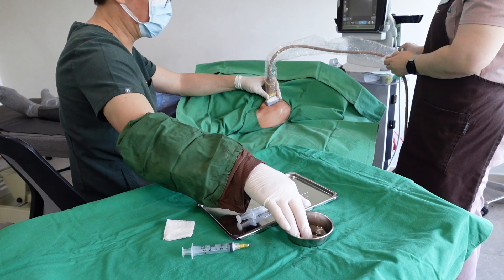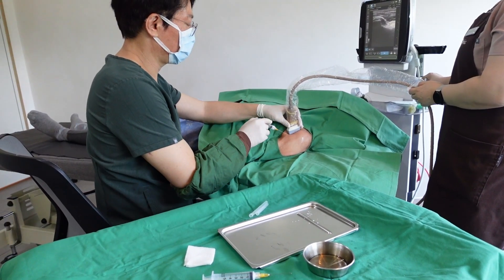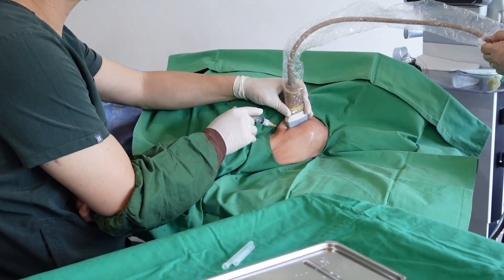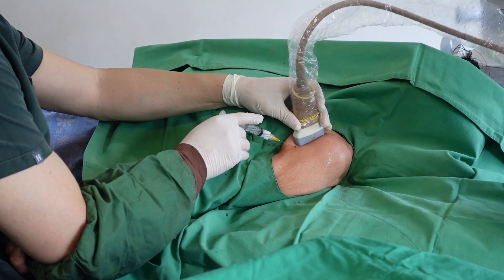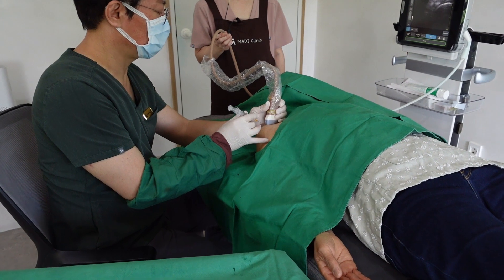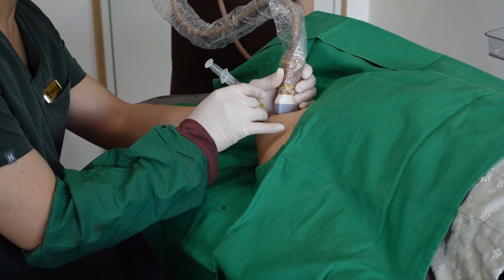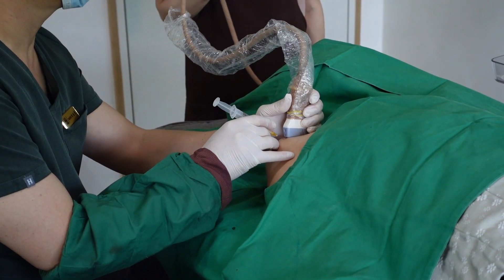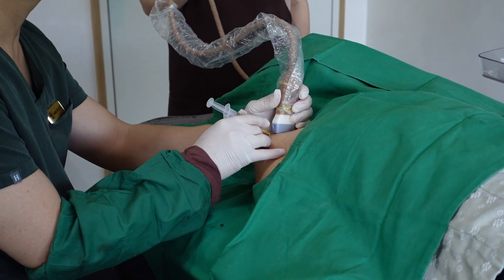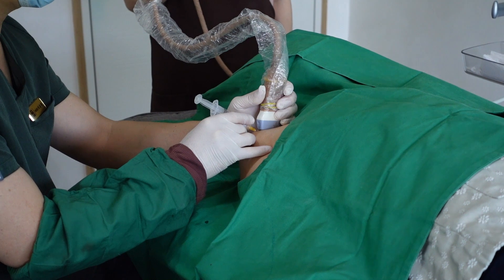During a procedure, it's essential to position the probe optimally while leaving enough space for needle insertion. Place the probe on the skin, ensuring proper contact with the aseptic gel, and adjust its position to visualize the target structure and adjacent tissues clearly. Identify a suitable entry point for the needle that provides the best visualization of the target and minimizes the risk of damaging adjacent structures. Calculate the path the needle will take under the probe to ensure safe and accurate needle insertion and guidance.